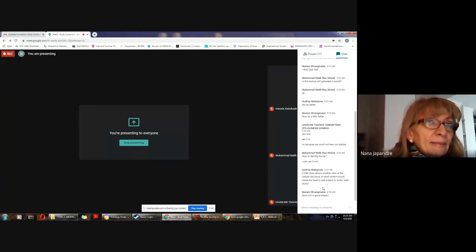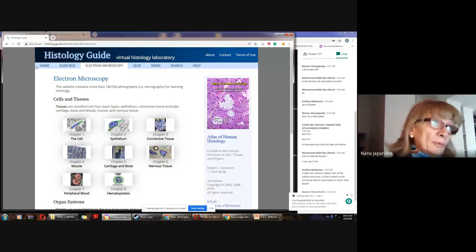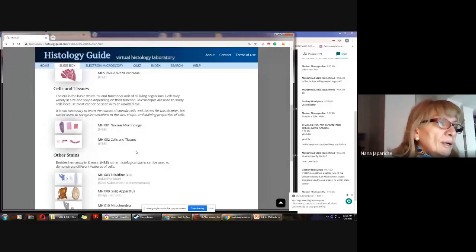Mostly basic staining is used to, I will show you the example and then explain this, okay? So, I will go back to the image. I will try to answer this question and then we will go look.